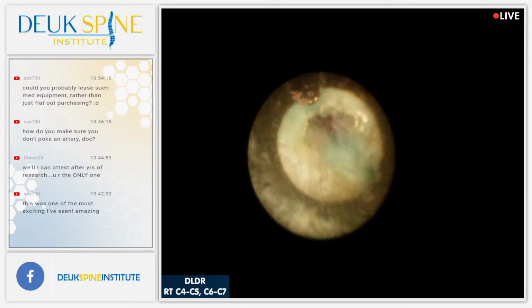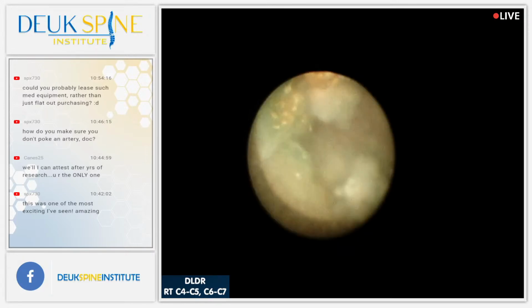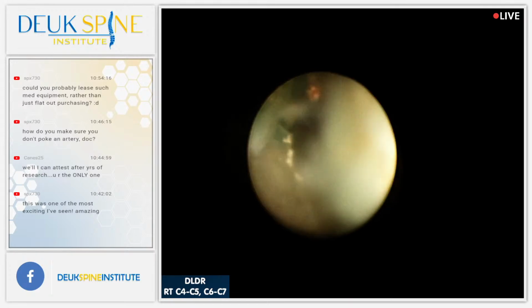10 years? Oh, yeah. 10 minutes left. Almost done. A lot of inflammation down there. You guys see it? The red stuff down there?